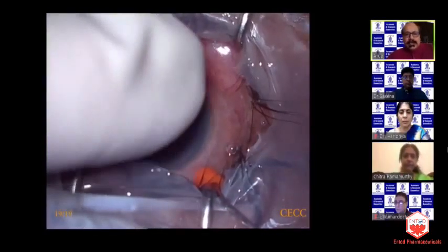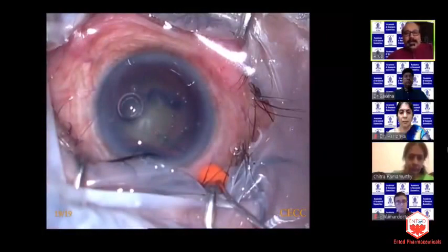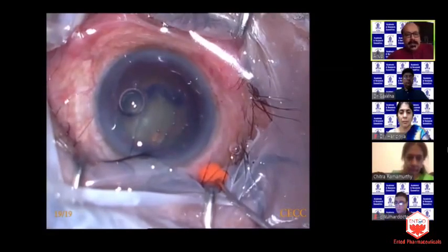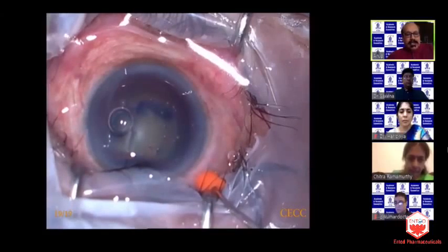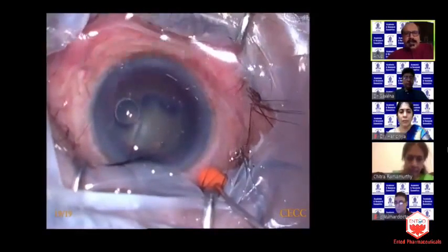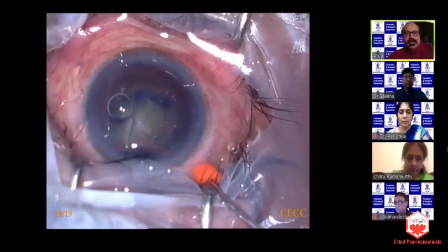Some people would suggest that you try to aspirate the vitreous with a thick gauge needle, but I think that is also not advisable at all, for fear of vitreous traction at the base and fear of retinal detachment. So I did the pars plana vitrectomy. I could see the vitreous cutter behind the cataractous lens, and I titrated with the intraocular pressure. Once I realized that the intraocular pressure is okay, I stopped the vitrectomy and continued with the next step.